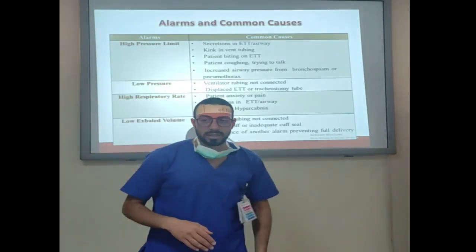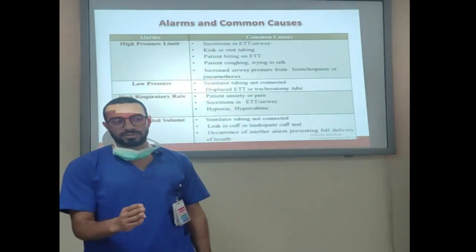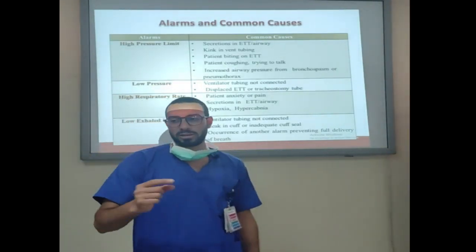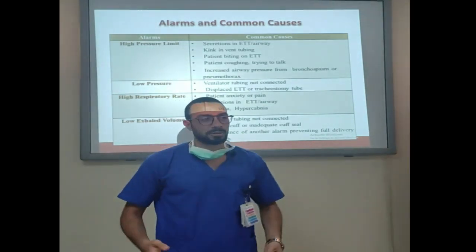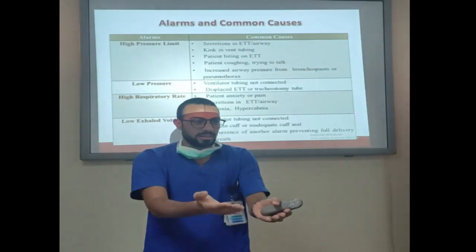Alarms, it's very important to know the alarm of any device in the ICU. It's not only the ventilator or any area, by the way. In all the hospital, you should know all the alarms of the devices, like the monitor, like the syringe pump, infusion pump, everything. You should know, because this is the trouble, and you should know the troubleshooting, what to do if you just see this alarm.